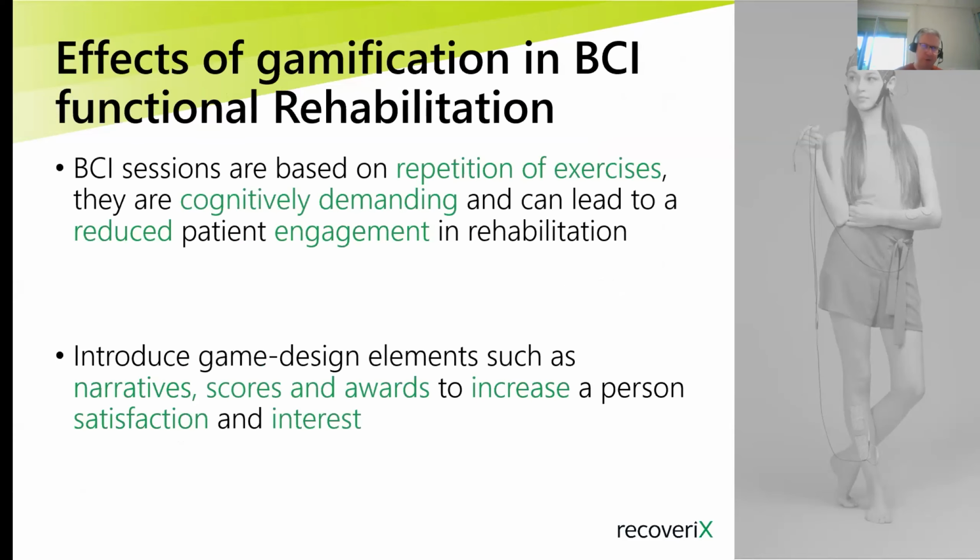Now I would change to the gamification. As I showed in the introduction, you do 240 trials per session, and this 25 times, or for multiple sclerosis, even 30 sessions. So it can become a little bit boring to always do the same movements and always just see your hands or your legs moving.